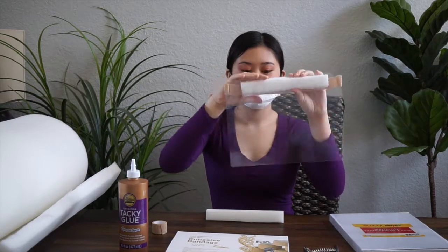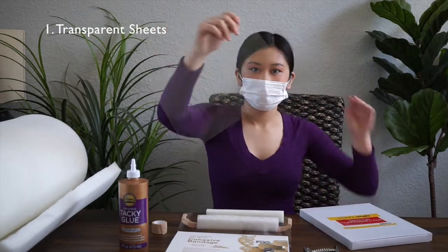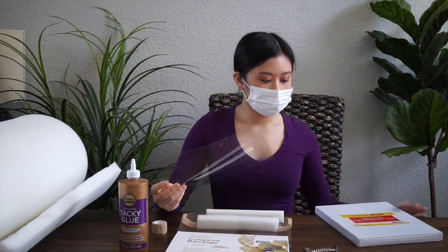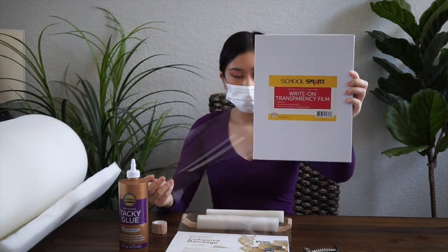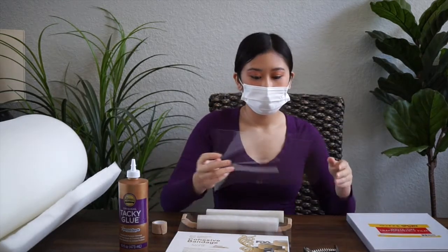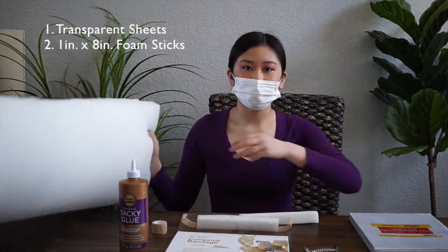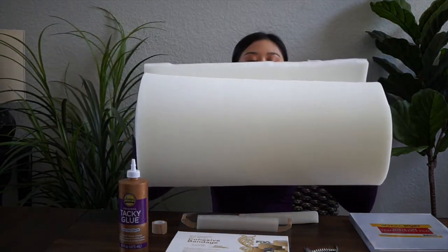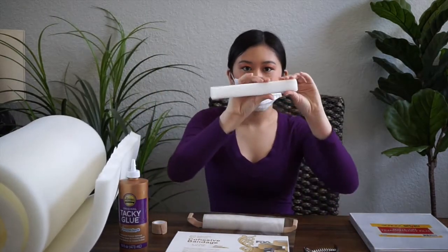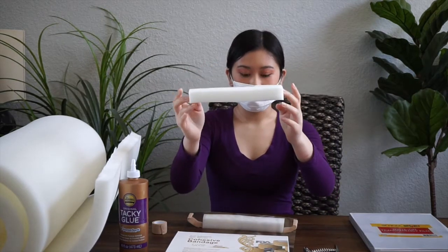They look like this. So all you're going to need are transparent sheets like that, which are going to be used as the physical shield. The ones we got look like this, and we got them from Amazon, but you can get anything similar. You're also going to need foam. We got a large thing of foam like this, and we just cut little strips. They're about 1 inch wide and 8 inches in length.